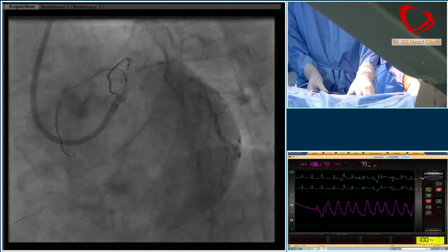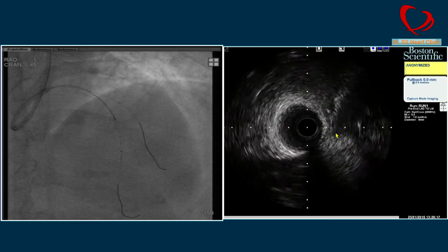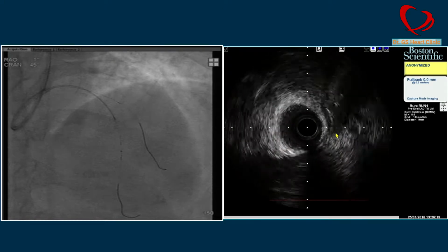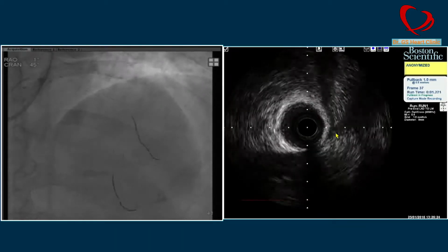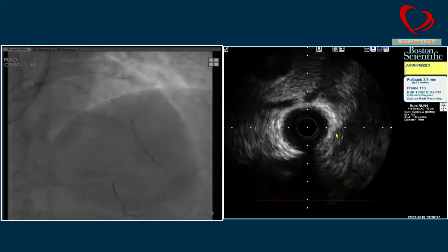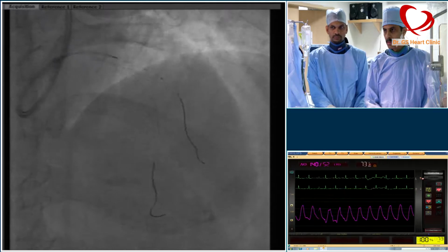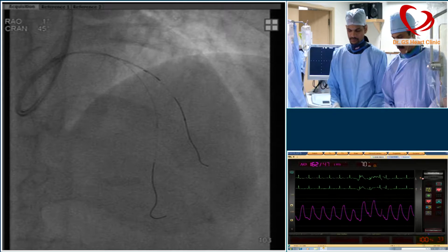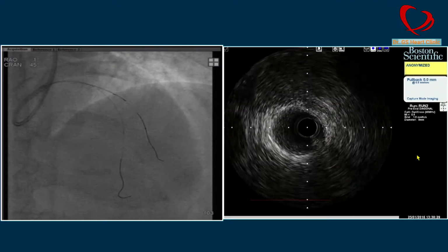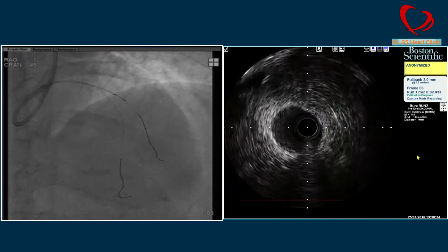That's fine. She's having pain, so maybe the IVUS catheter is reducing her blood flow. So this is starting from the mid LAD. We'll do a pullback quickly because she has pain. So we'll do a quick pullback. Yeah, pullback started. Yeah, bring it more forward. Yes, start. Can you show the IVUS? So this is a run from the diagonal. So we will do a quick IVUS run.